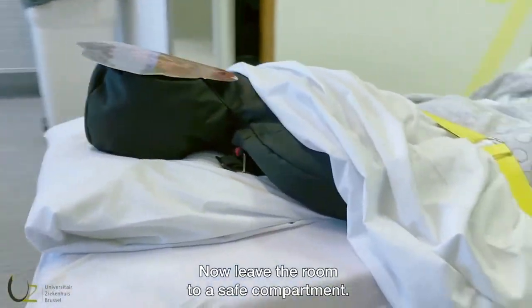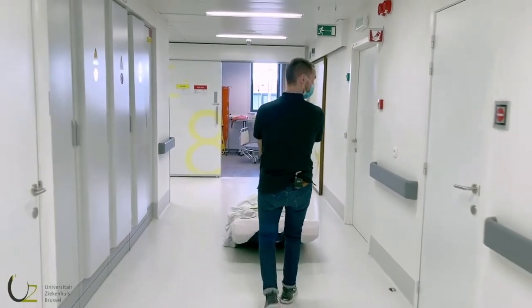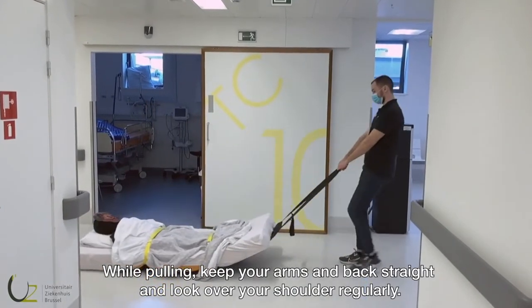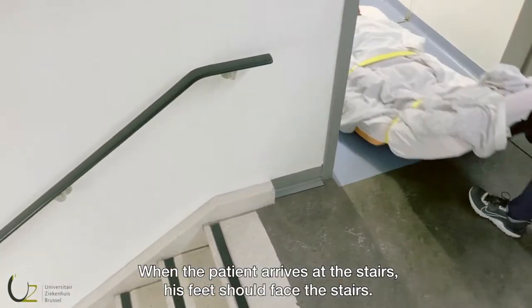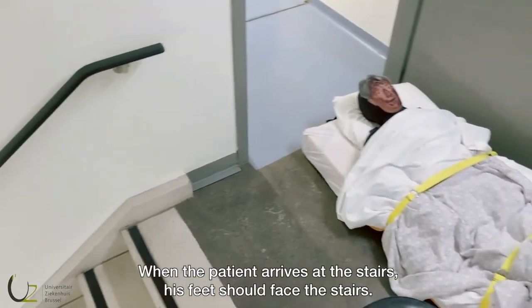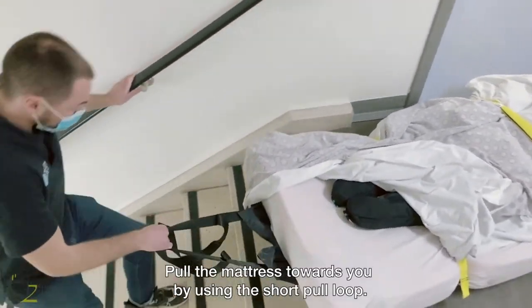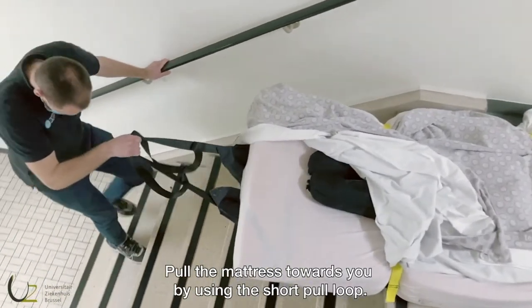Now leave the room to a safe compartment. While pulling, keep your arms and back straight and look over your shoulder regularly. When the patient arrives at the stairs, his feet should face the stairs. Stand a few steps lower. Pull the mattress towards you by using the short pull loop.